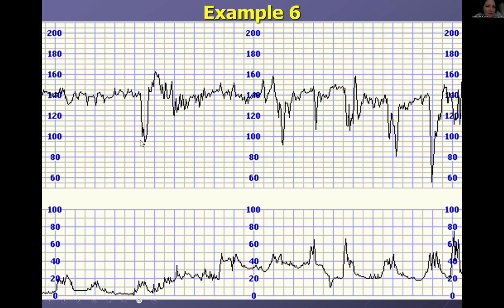What about the baseline rate? What would be the baseline rate, you think? Okay, Prof. For baseline, this is quite tricky. Yes, I told you, they start becoming more difficult. Baseline, I would say 140. Yes, definitely 140, but it needs to be corrected if you follow the trace.